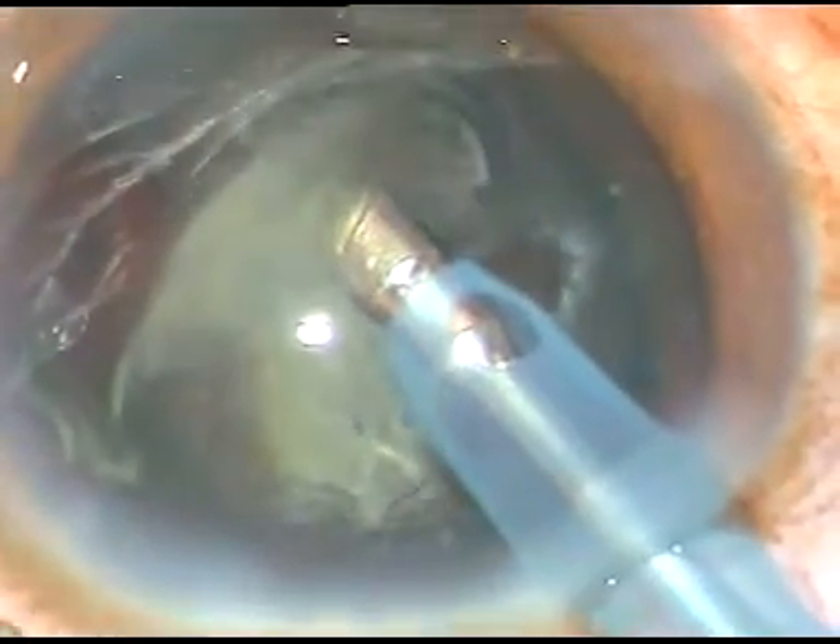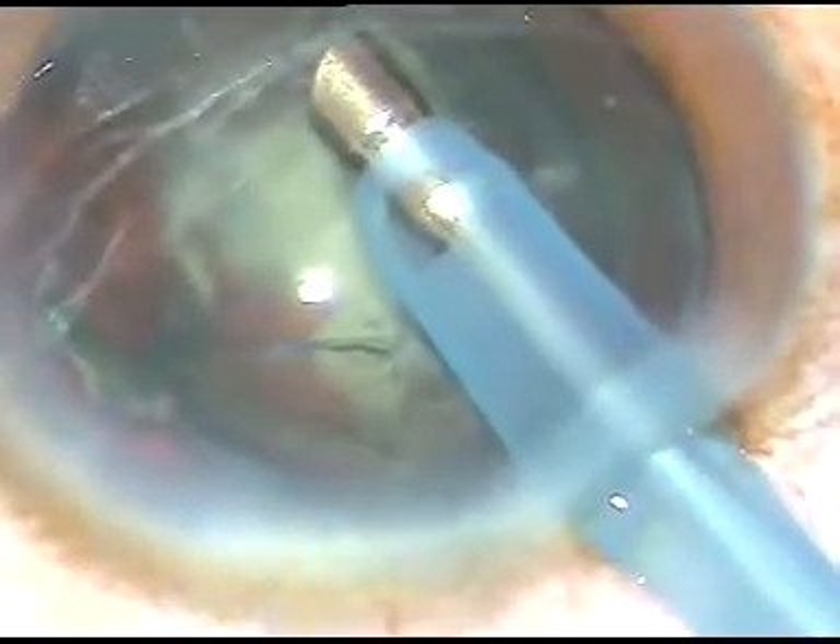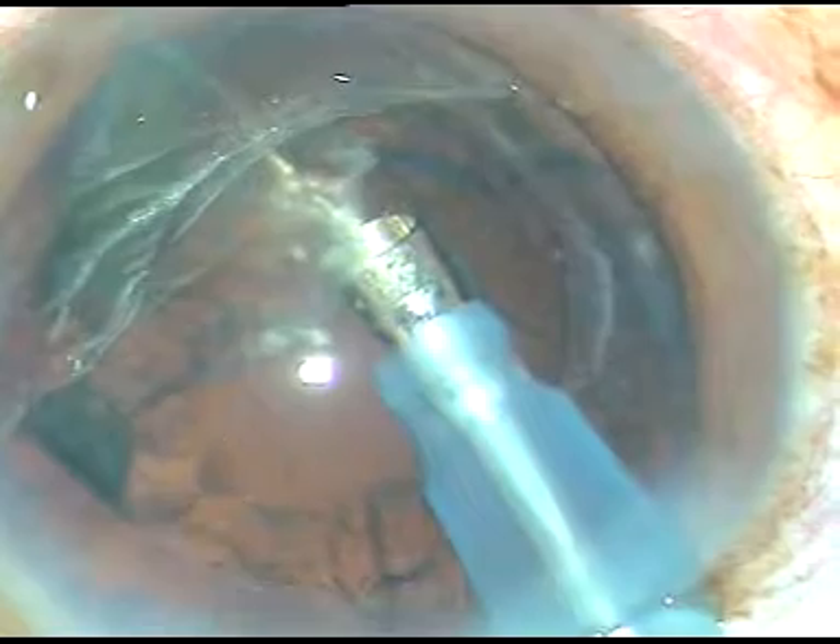The epinucleus all around is there. I have been able to remove the nucleus — which would drop if I don't manage it like this. Now, I am trying to pull the epinucleus. I have removed a portion of the epinucleus. I turn to the opposite side and try to remove the epinucleus, and here I find that the PC rent is already there. Before I try to emulsify this, I want to put some viscoat to plug this posterior capsular rent.